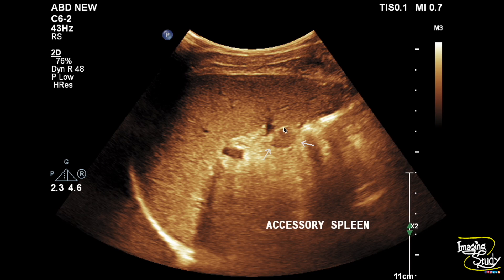Here is the picture of the capsulated well-defined structure, the echogenicity of which is the same as the adjacent spleen, located at the splenic hilar region. The structure measures about 12 millimeters by 10 millimeters. No other abnormality is seen.